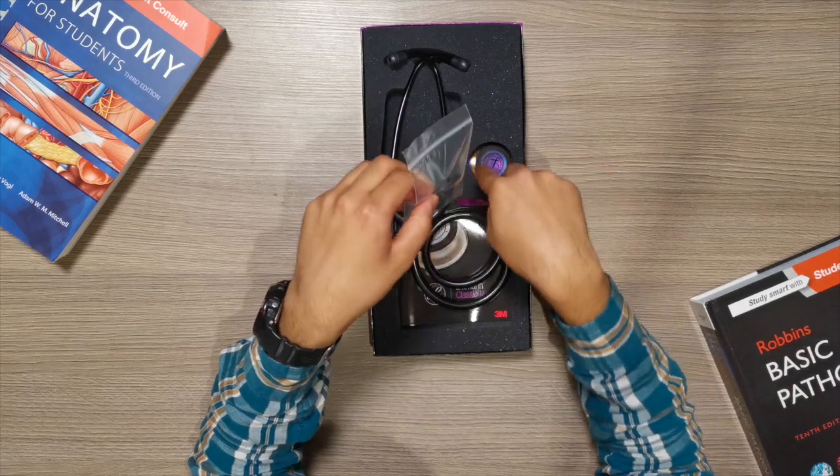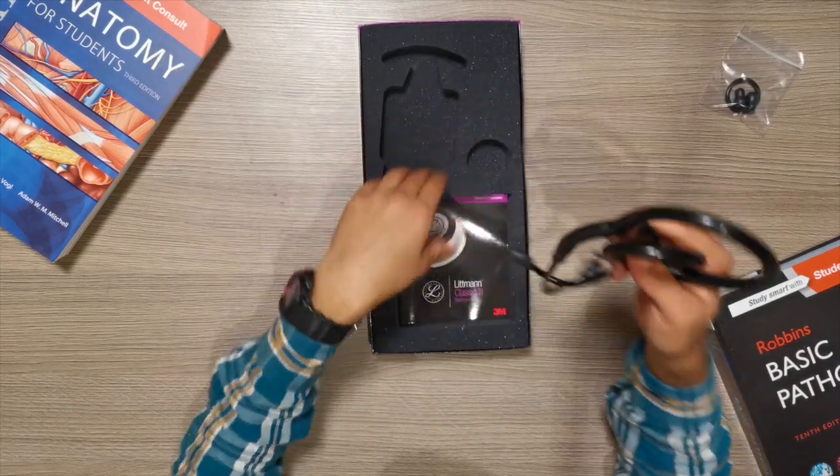This is just a receipt, and then we have the earbuds and a loop that you can attach on the side, the stethoscope itself, and then a manual.